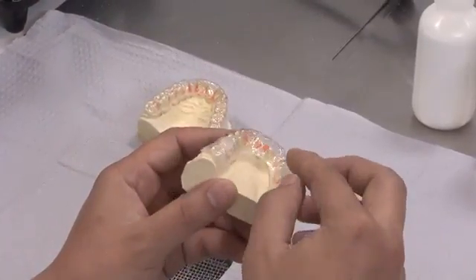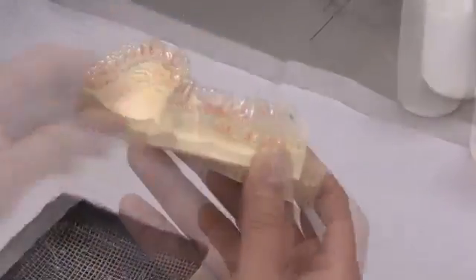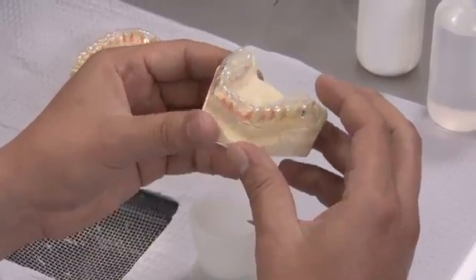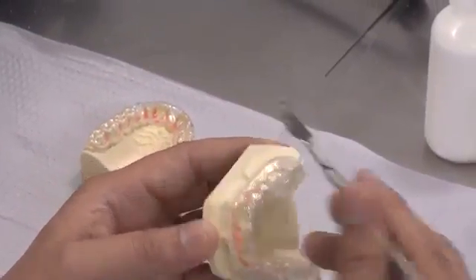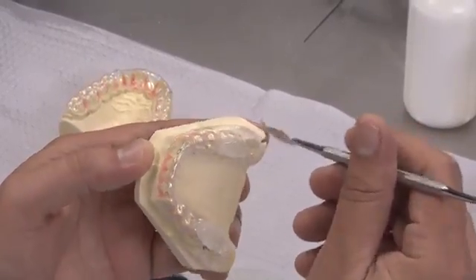Place the bite pads on the occlusal area above the molars. Do the same on the other side of the arch. Closely examine the placement of the bite pads to make sure they are on a flat plane. Place acrylic on the buccal area over the marks on the lower model.